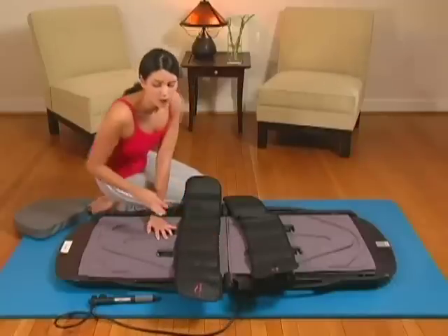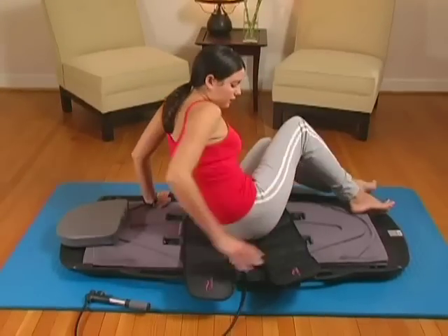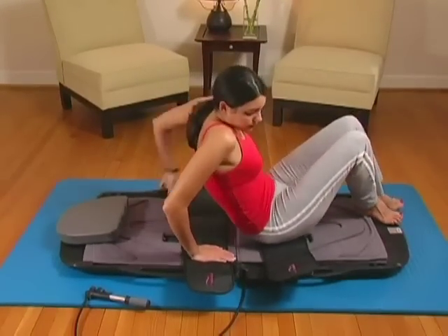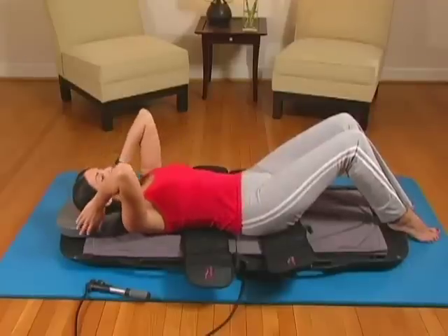For increased comfort, place the Swedish foam pillow at the top of the unit. Lie down on the device placing your torso on the upper end of the unit. Secure the two adjustable belts over your torso and lower your hips respectively.